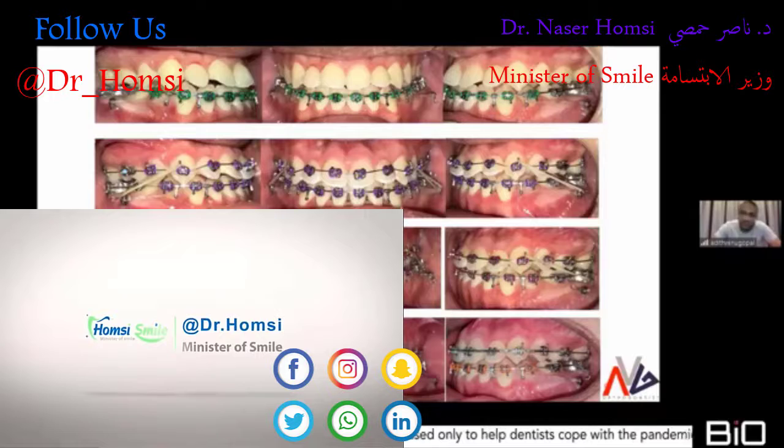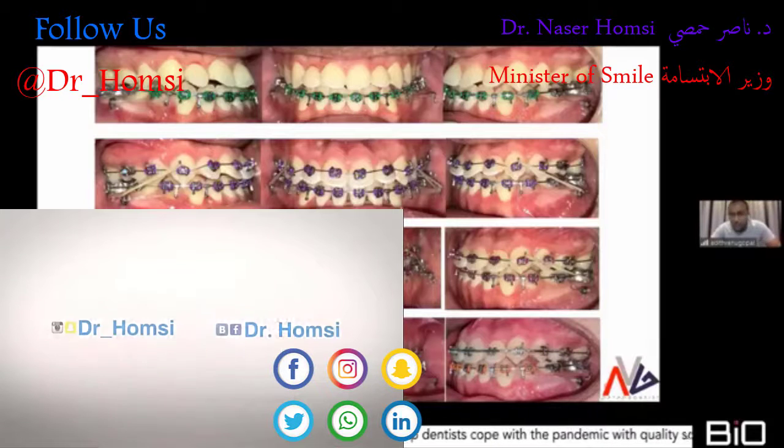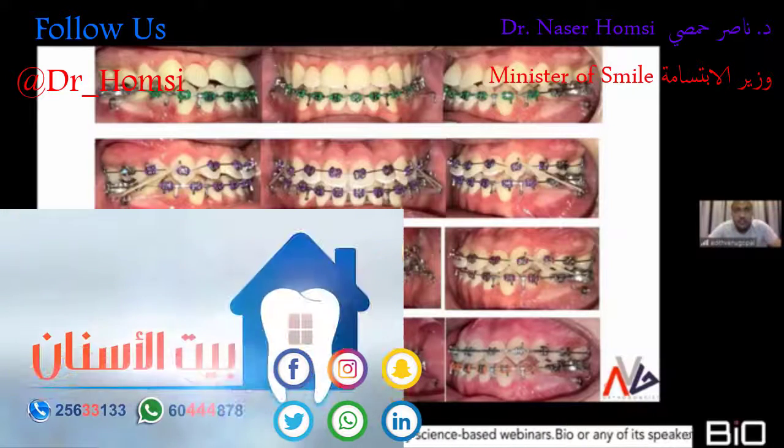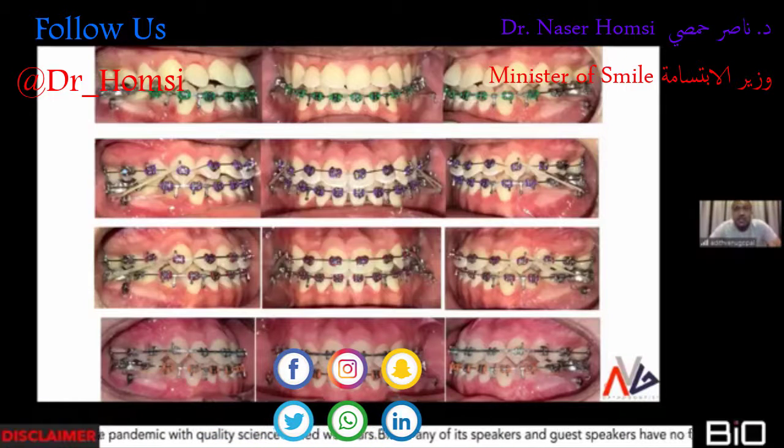What I'm trying to show is not the mechanics over here, it's the use of conventional brackets for even such cases. Most of you would have it etched in your head because of the notions that you see on social media, etc., that self-ligation and buccal shelf can go with Damon. So, I mean, it's a standard. I think Dr. Pao would also agree with it. Buccal shelf equals Damon with buccal shelf distalization. It's always like that because that's how we see it.